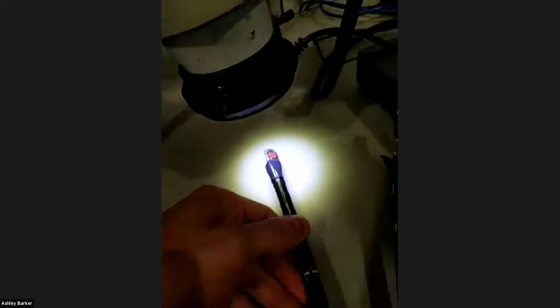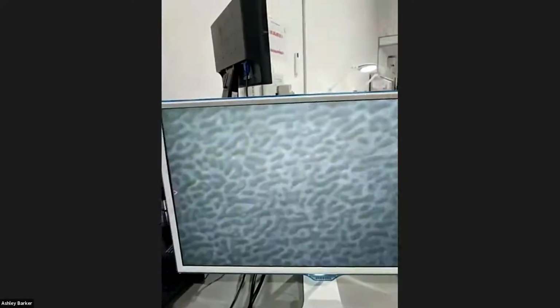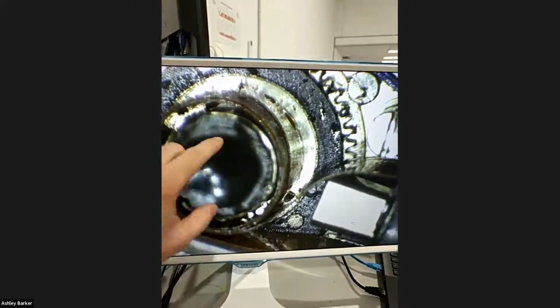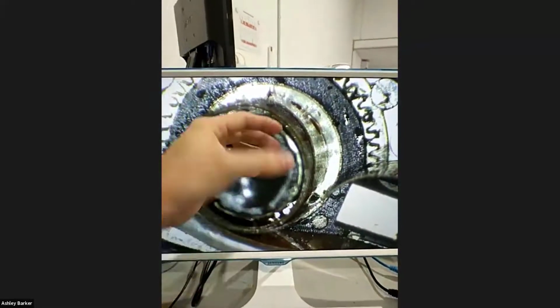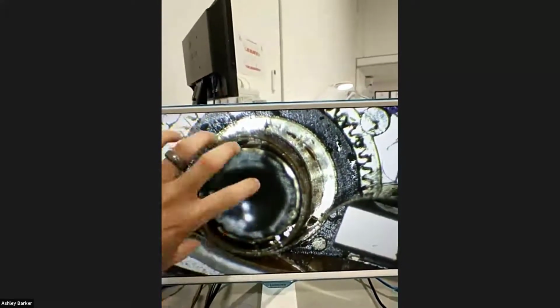When you use the steering controls on the probe, that array spins around to allow you to change the plane that you're looking at. So if I now spin that back around, in order to do that, you can probably see this spiral that comes in here and wraps around. That's a flex circuit, which is all of the element wires coming into this central pillar, and that goes down to the array that sits underneath. And then this geared cog around the outside is what actually allows the whole thing to spin.